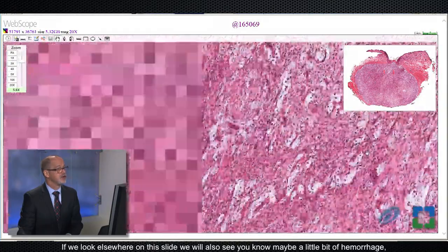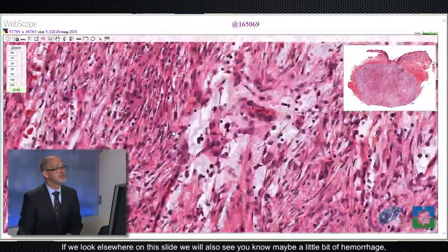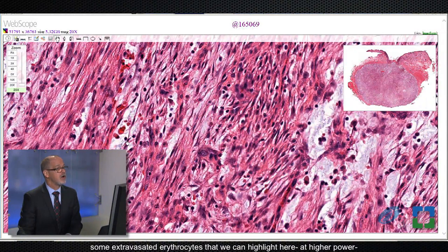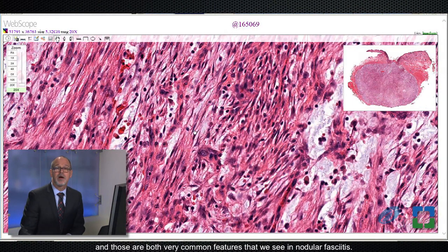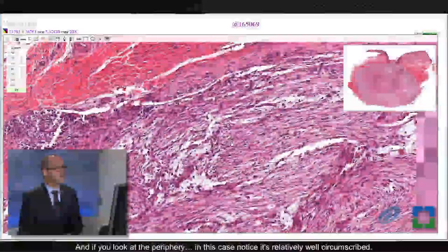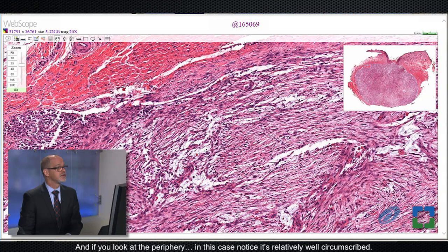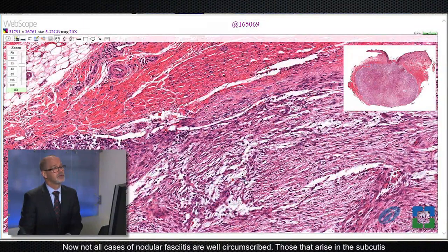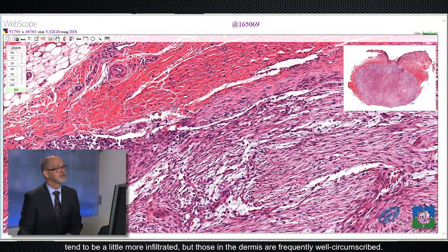If we look elsewhere on this slide, we'll also see maybe a little bit of hemorrhage and some extravasated erythrocytes, which are both very common features in nodular fasciitis. Looking at the periphery of this case, notice it's relatively well circumscribed. Not all cases of nodular fasciitis are well circumscribed — those that arise in the subcutis tend to be a little more infiltrative — but those in the dermis are frequently well circumscribed.